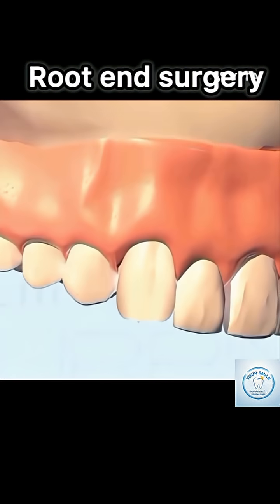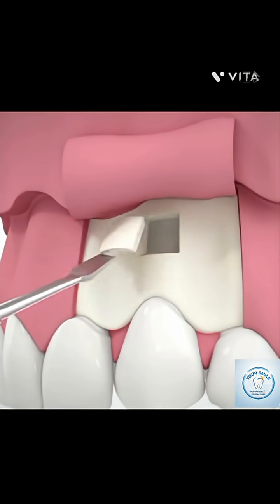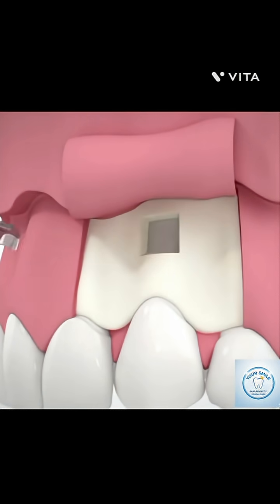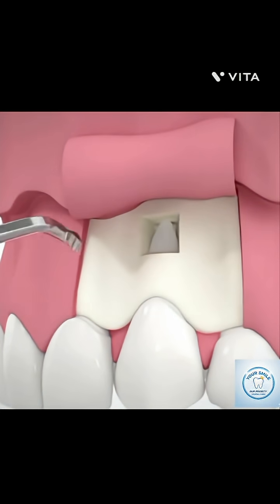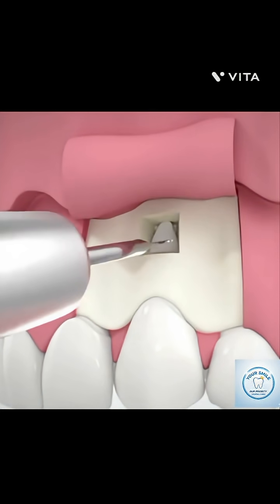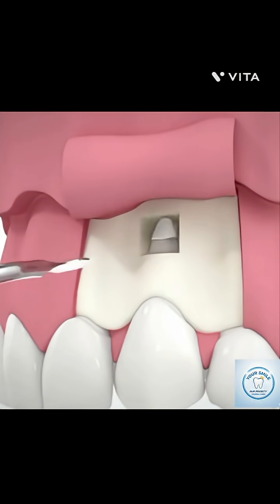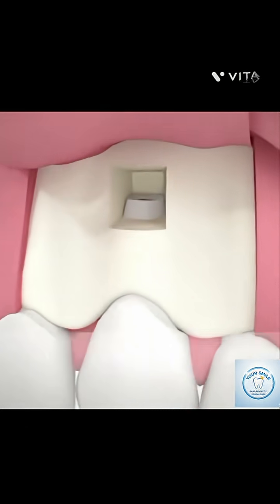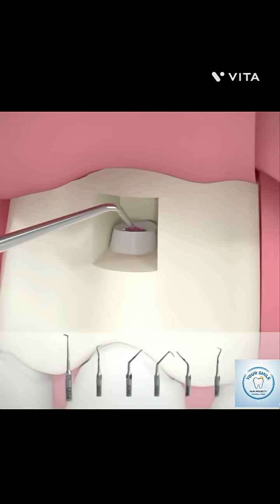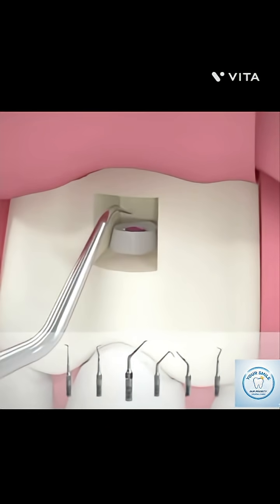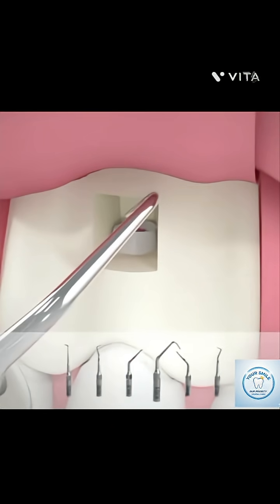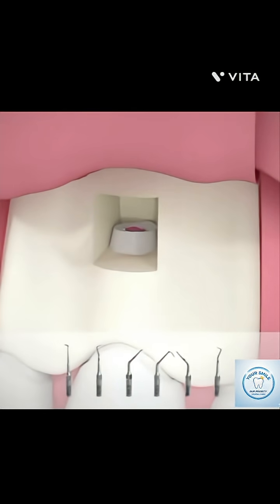This apical portion is removed because it is the area most likely to harbor bacteria and accessory canals. Using an ultrasonic micro-tip, a small preparation or cavity is placed into the remaining root canal space, which is then sealed with a biocompatible material such as MTA, mineral trioxide aggregate, or a bioceramic cement. This step, known as the retrograde filling, seals the root canal from the tissue fluids.